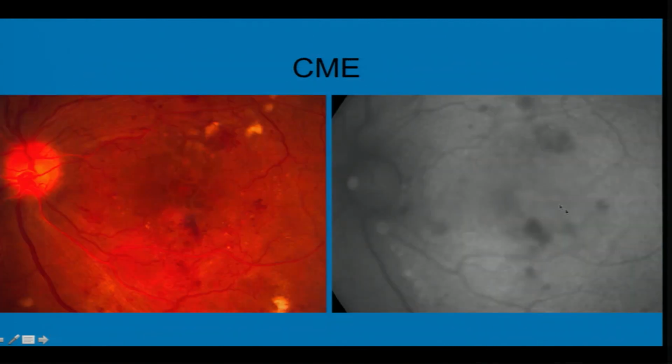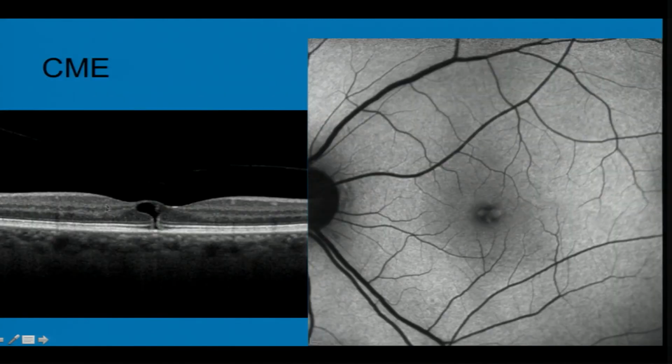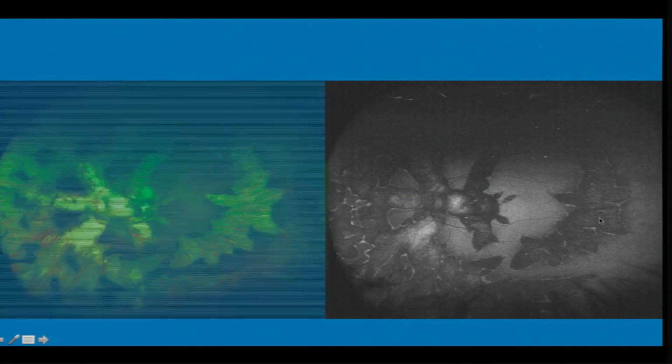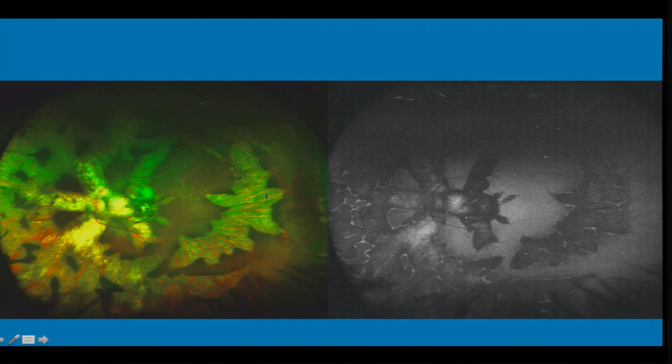Intraretinal fluid can again appear hyper-autofluorescent, not very clear. Just to show you the difference between the CSLO based image and the fundus camera based image, it appears hyper-autofluorescent, but if you go on to a CSLO based image, we can clearly see that cystoid edema would lead to hyper-autofluorescence. Sometimes autofluorescence cannot give you a good image, as you see here, but if you go to the color image, the images can be quite striking. We are dealing here with a patient of Sveinsson chorioretinal dystrophy.